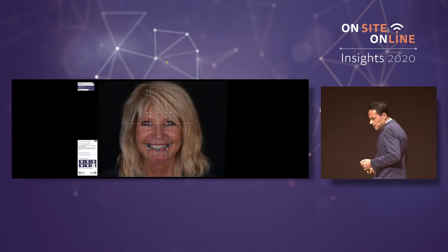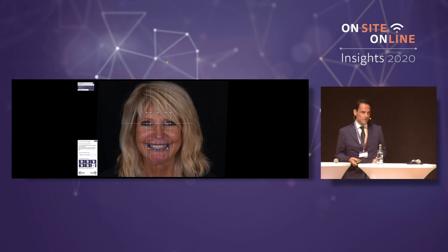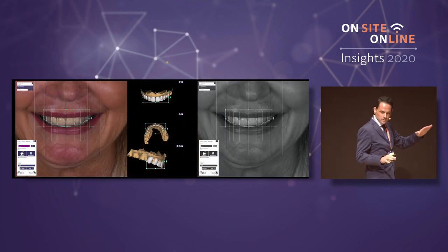I need to distribute these spaces, the Spee curve. This is very easy, step by step. Sometimes I use the same shape of the patient's teeth. I have shown you how to do that in other presentations. Sometimes I use dental libraries. I have used a dental library on this patient, the best of two worlds.